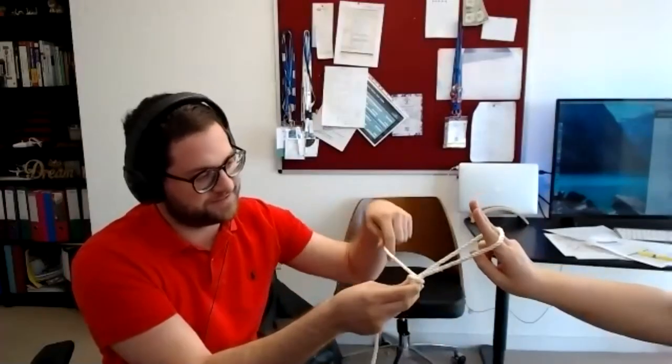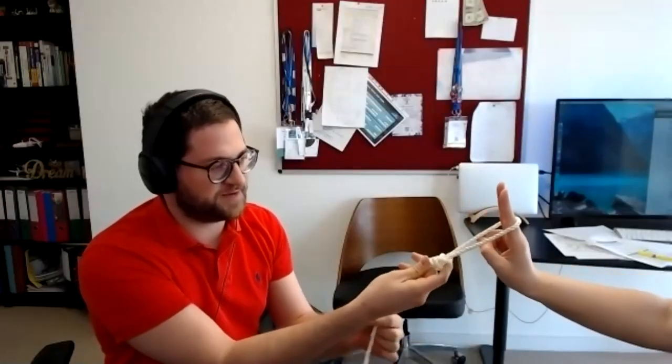So this will be my needle end. I will start with the reef knot. Going twice around. One, twice. And then half. Tidying up my knot. And that's it.